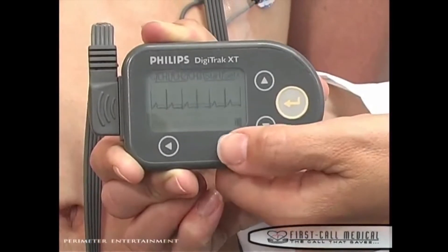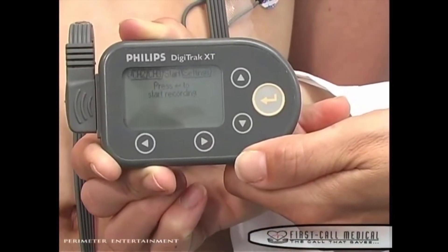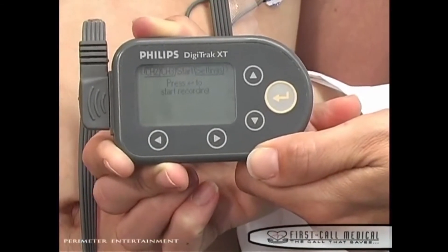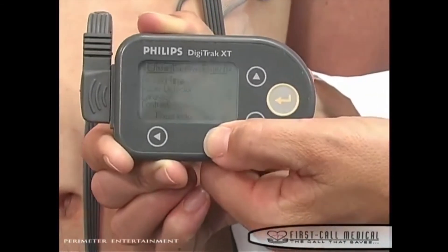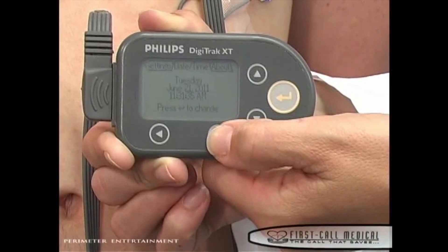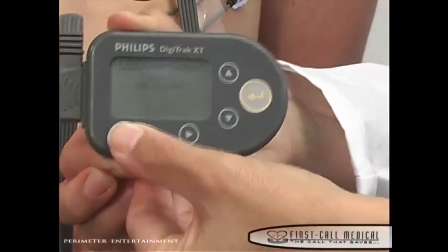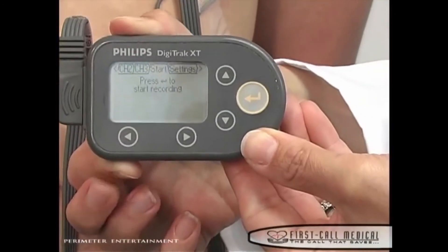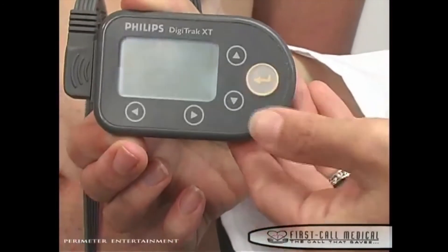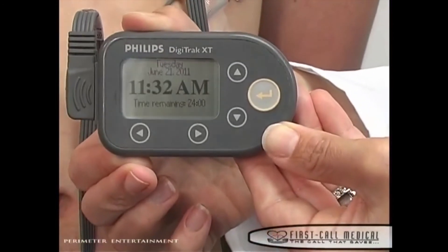Continue to press the right arrow button until you arrive at the date and time tab. Confirm the date and time, and make changes using the arrow keys if needed. If the date and time are correct, arrow back to the start recording tab and press the gold start button to begin recording. You will see the current time and the time remaining for monitoring.